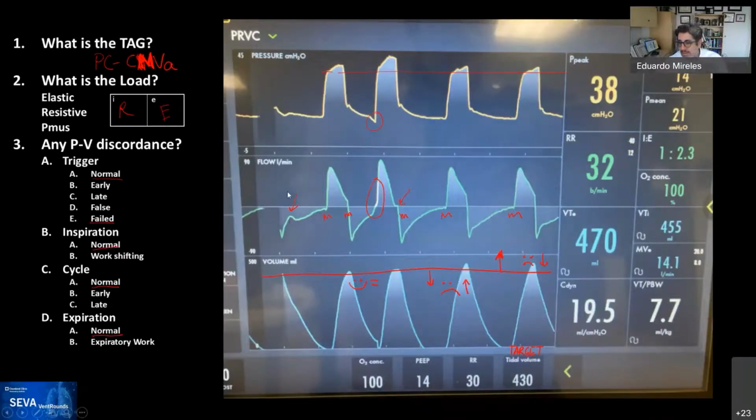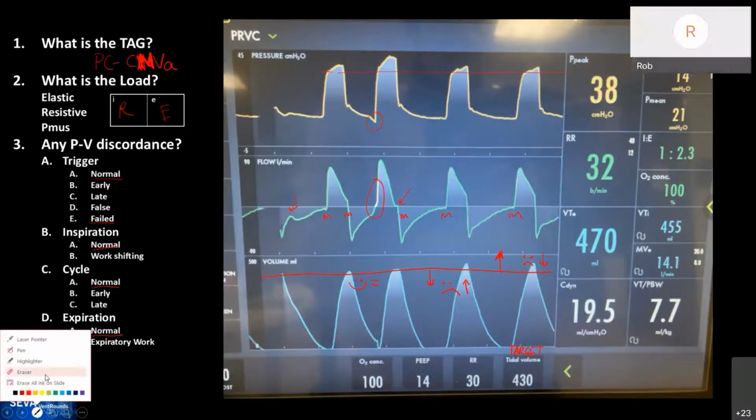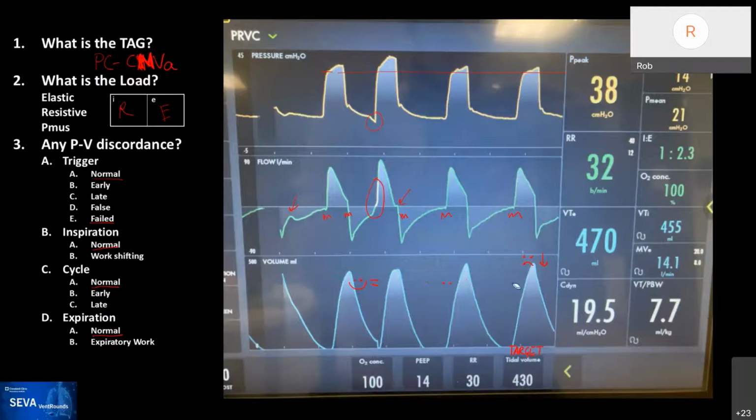All righty. Questions about adaptive? Another point about what you said about the target tidal volume. Some ventilators target the exhaled tidal volume on the previous breath. Some target the inspired tidal volume, and others, like the Hamilton ventilators, average the two because they don't know what's the right number. And that has various implications. For example, if you have a huge leak out, an uncuffed endotracheal tube or a big leak through a bronchopleural cutaneous fistula. So those are all things to keep in mind.